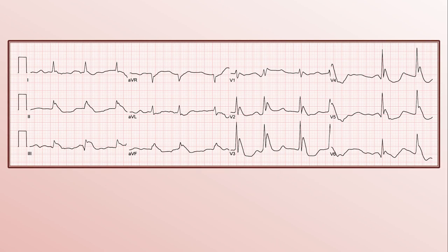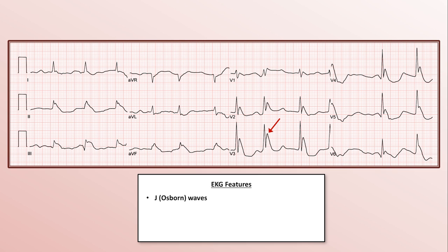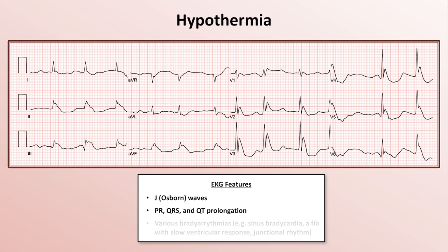Here's the EKG of an elderly person found down on the sidewalk. There is an irregularly irregular wide complex rhythm of about 72 beats per minute, no unambiguous regular atrial activity, so maybe AFib. If we look at V2 and V3, the QT seems prolonged. But what really stands out once you've noticed it is the unusual terminal deflection of the QRS complex — it looks sort of like an R' wave, but it's really wide. This is called a J wave, or more commonly in the US, an Osborne wave, the hallmark of hypothermia. Other EKG features seen in hypothermia include PR, QRS, and QT prolongation, and various bradyarrhythmias including AFib with slow ventricular response.